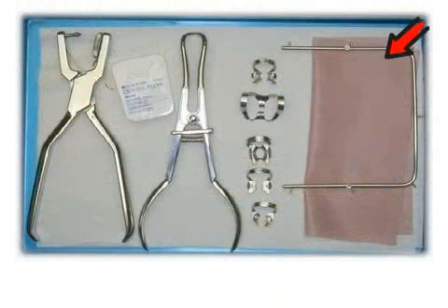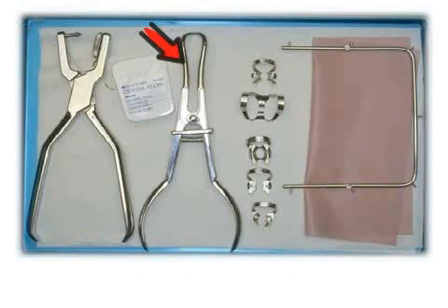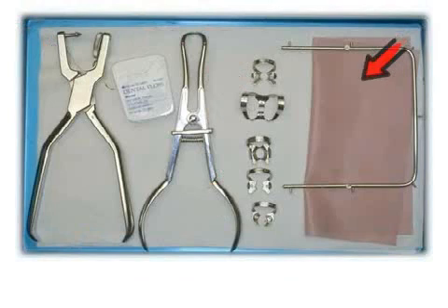Here you see a dental dam set consisting of: a punch, special pliers, dental dam clamps, a dental dam frame, and the already mentioned latex membrane.